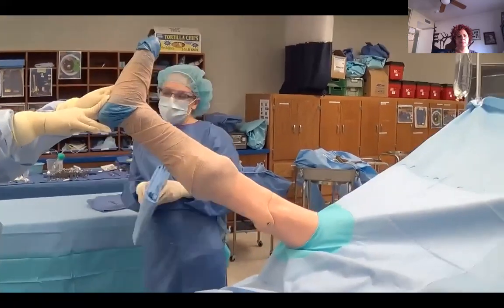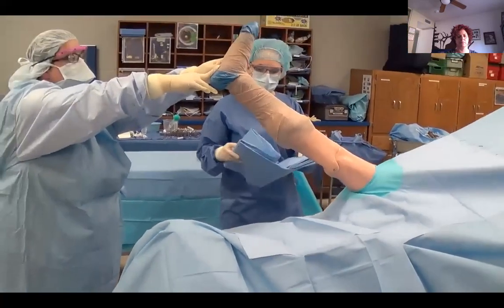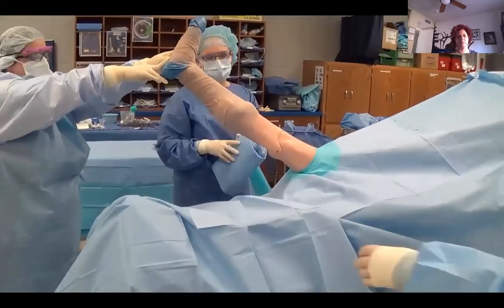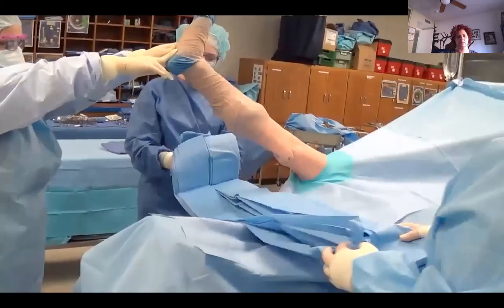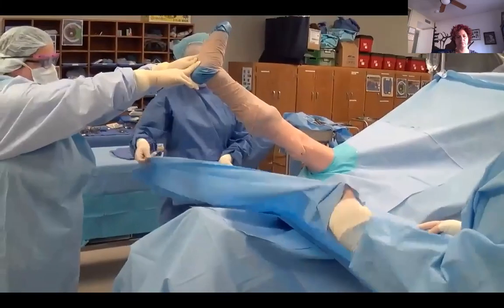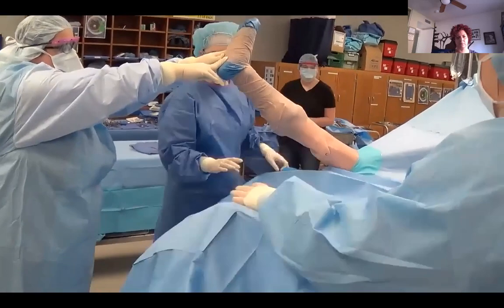Now, because in orthopedics, we tend to use a lot of heavy instruments that have sharp edges, a lot of times we will add an extra layer of reinforcement down here. So we'll add a 3/4 sheet. So again, we just open it up, cuff our hand, and extend that out over the foot of the bed.